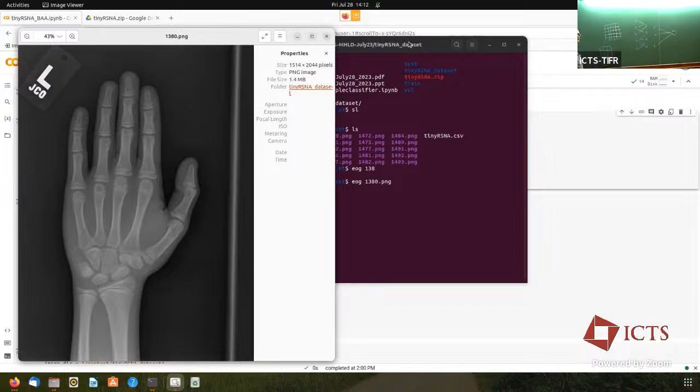A kernel is a specified weight matrix. Okay, so there are values over here. Think of this as a weight matrix. That weight matrix does a dot product with this. It's not the dot product, it's a convolutional product. Take this, place it over here, multiply element to element, and take an average.